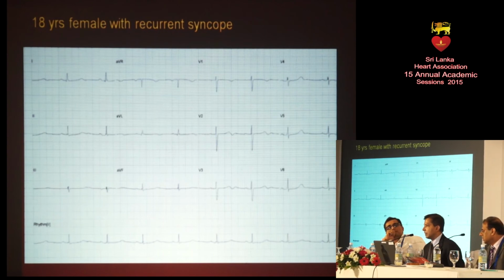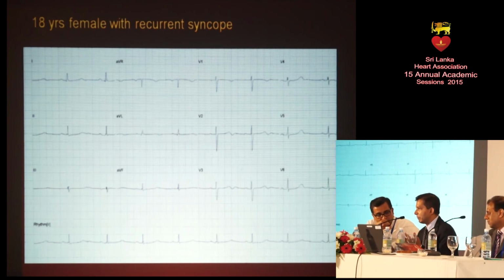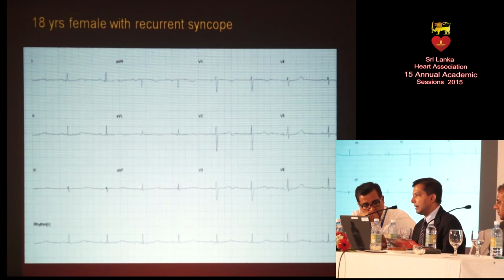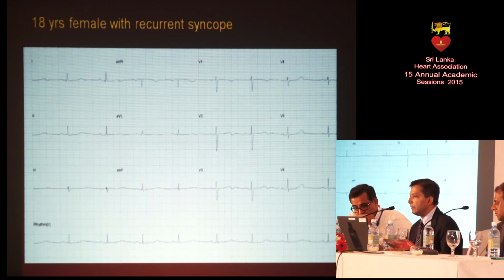Now, after listening to Dr. Brugada, could this be a channelopathy, sodium channel, whatever, the Lenegre disease, Lev's disease manifesting early? I mean, those things come to mind, because other more common things like amyloid, which is unusual in this case, sarcoid, which is unusual, I believe.